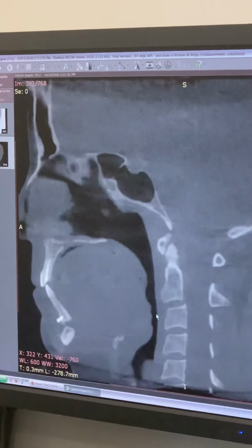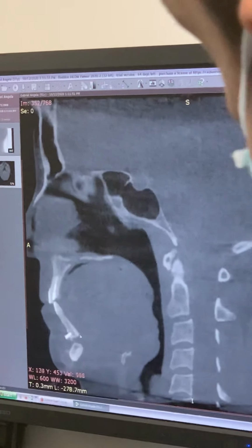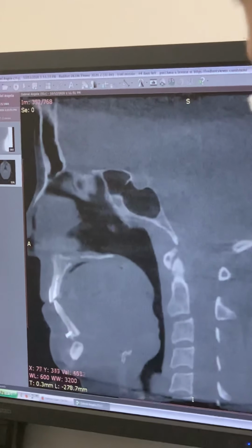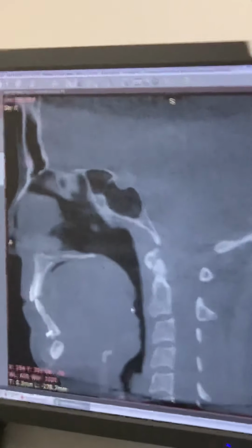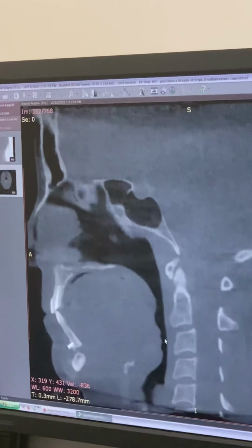Number two is your posterior airway space. This is your tongue. This is your upper jaw, lower jaw, upper jaw. This is your spine. So posterior airway space, pharyngeal space, is the amount of space you have in your pharynx. Is this making sense at all?